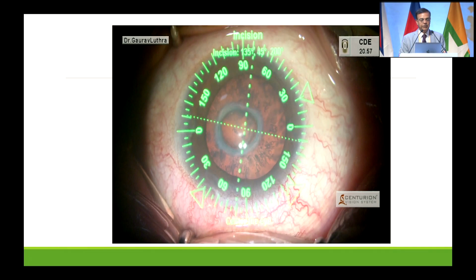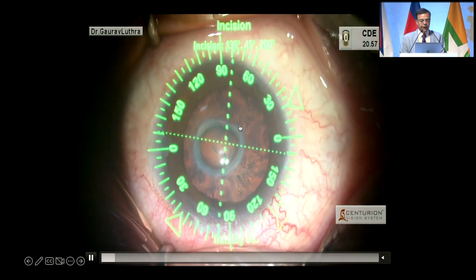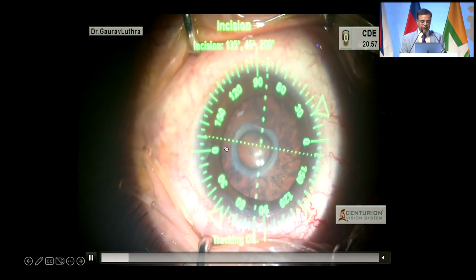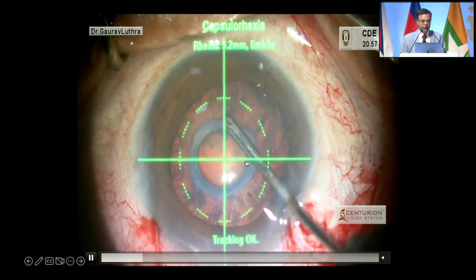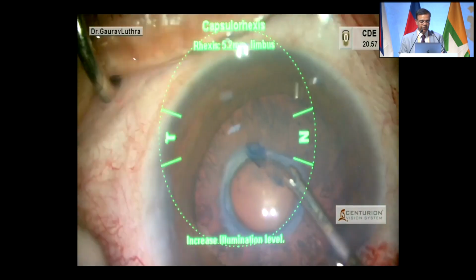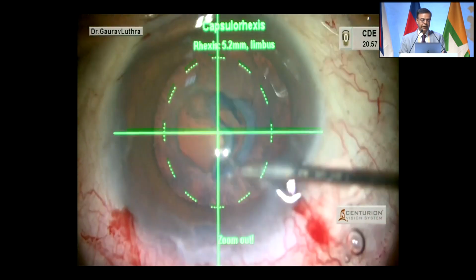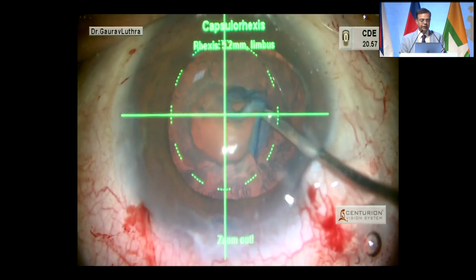It was a proper cataract formation, and there was a fibrotic ring and a central clearing where the lens had given way. The cataract had almost melted. So I had the difficult task of retrieving whatever I could from this eye. This is a nightmare situation, so one has to be extremely careful when implanting phakic lenses.